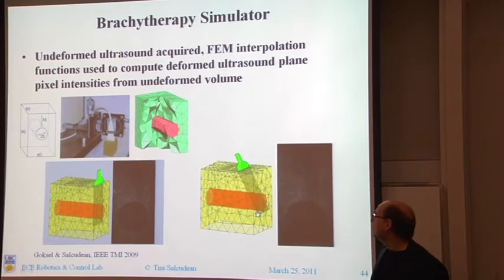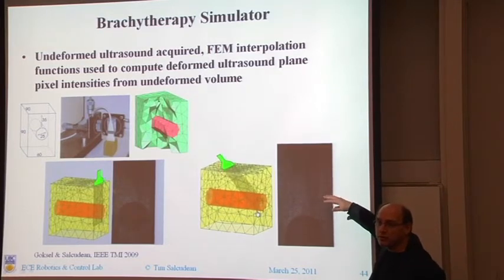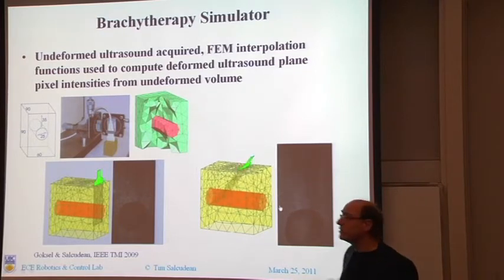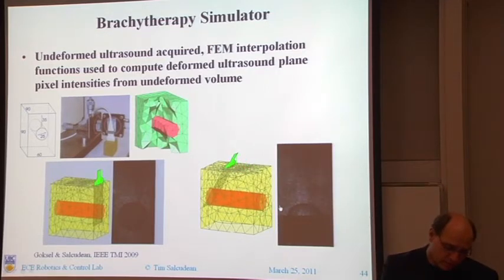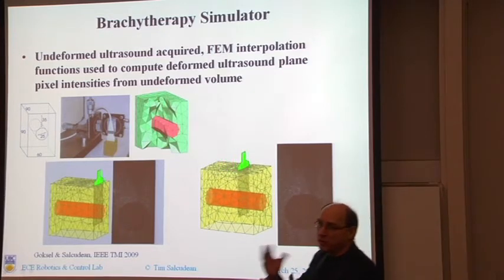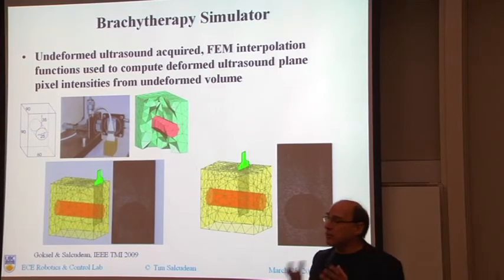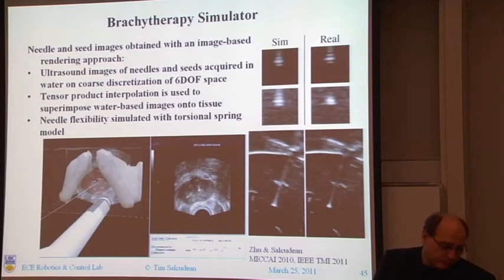Okay, so I don't know how many of you are used to seeing ultrasound images, but most people, including radiologists, cannot tell the difference between the real deformation and the simulated deformation using our techniques, because it's actually based on the acquired data. Okay. So with the ultrasound model of the prostate that we acquired at volume study time, and with the finite element model based on elastography, we can simulate how the prostate would deform.